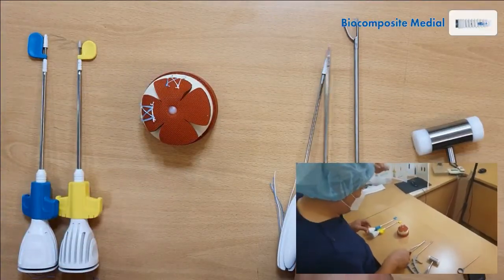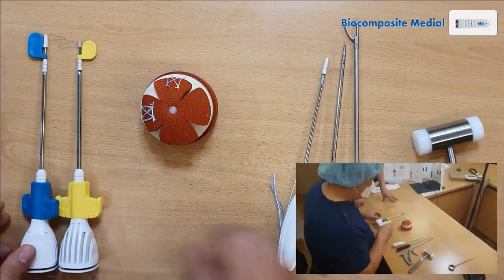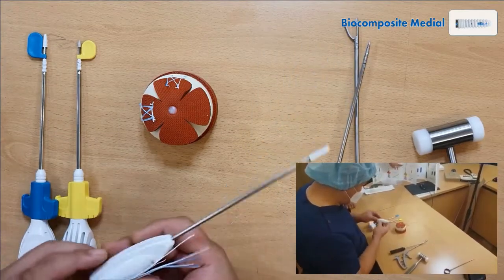Hello, my name is Chris Potter and I'm going to show you how to use the medial anchor made from Osteonic.